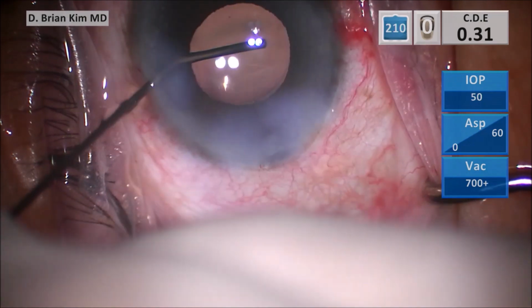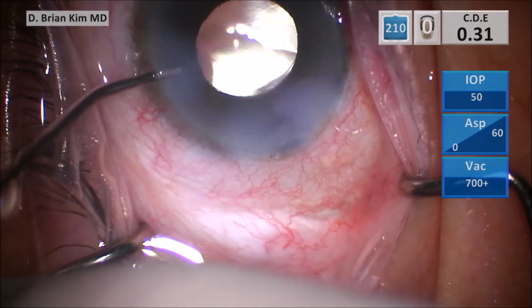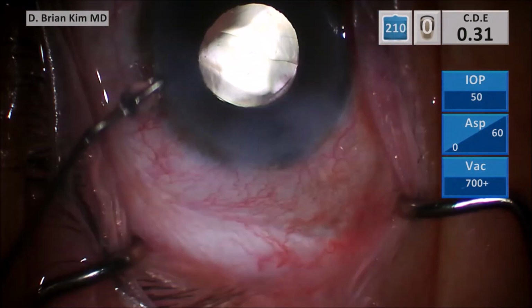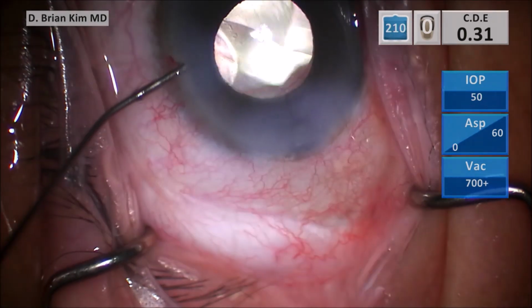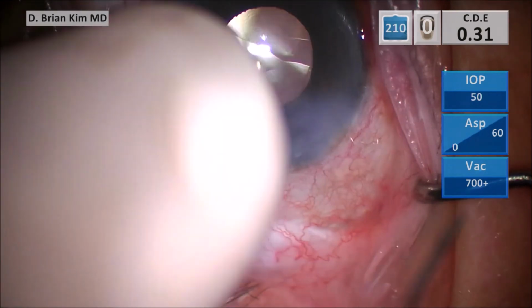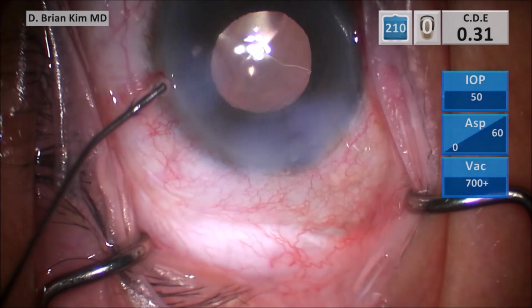Lastly, you saw that I used a two-handed technique using the cannula to free the haptic off the optic. So whenever the haptic is stuck, you can try a one-handed maneuver, but when needed, using a two-handed maneuver is a much more controlled and effective way to release the stubborn haptic off the optic.